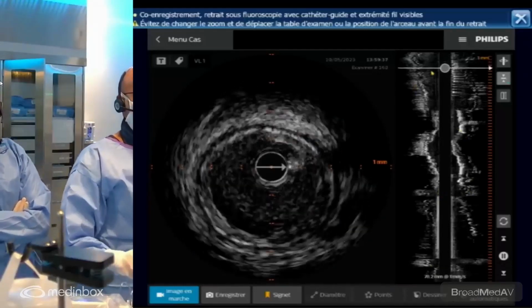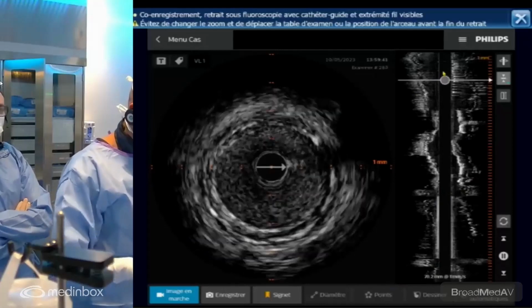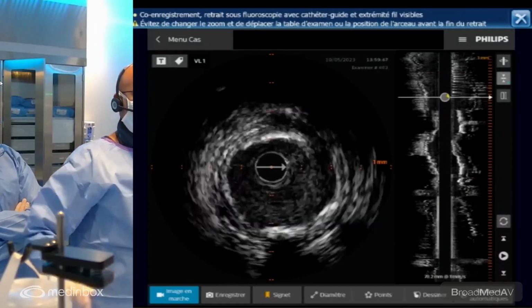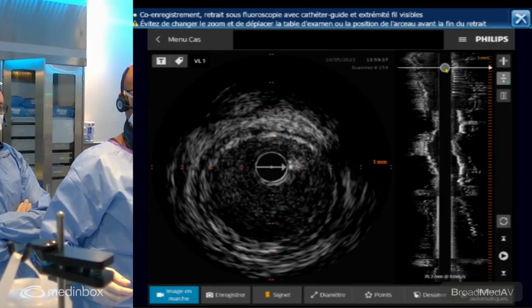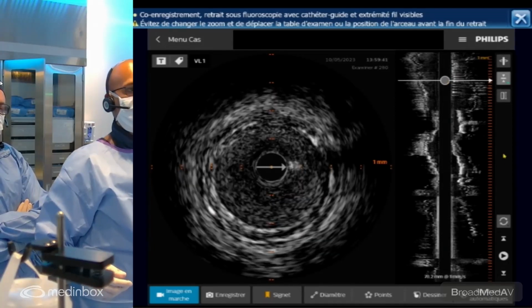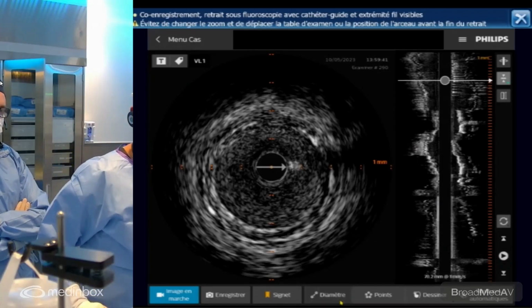Let's get a measurement on the very distal segment just before the lesion. Distal, Mathieu, distal au début. Ouais, ici, juste avant la lésion. Avance encore. Go further down. Avance. More. There you go. Yeah, stop. Let's measure that. Let's get diameters on that or use auto measurement. Yeah, diameter.